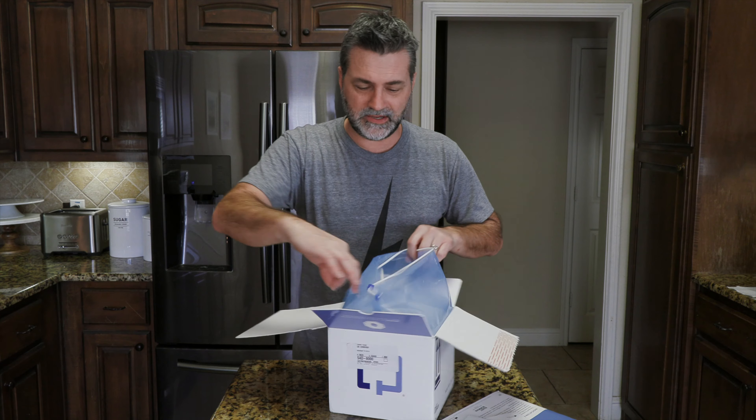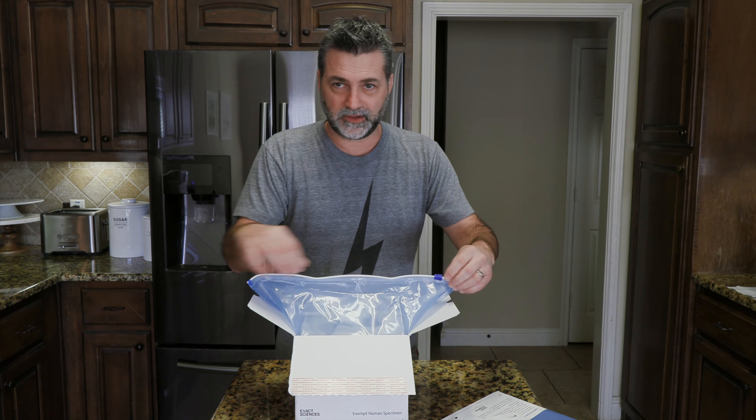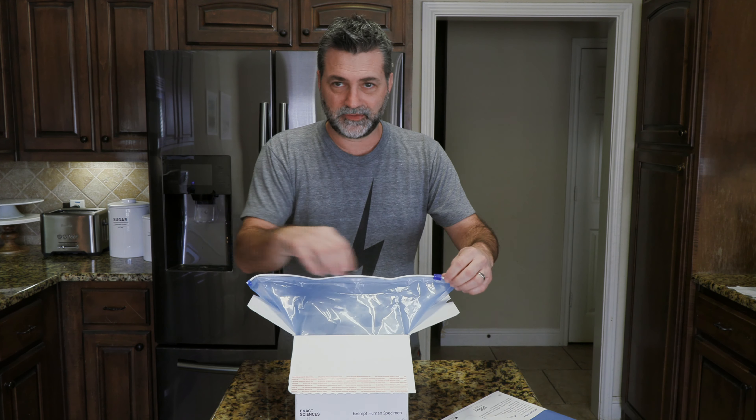You keep this little plastic Ziploc thing in the box. When you open that up, there is this thing which sits on the toilet seat. So you raise the toilet seat up, sit this down, and then put the toilet seat back down. This is basically what you poop in. So this goes down in here, and you do your business inside this. This is the lid for it — of course you've got to have a lid.